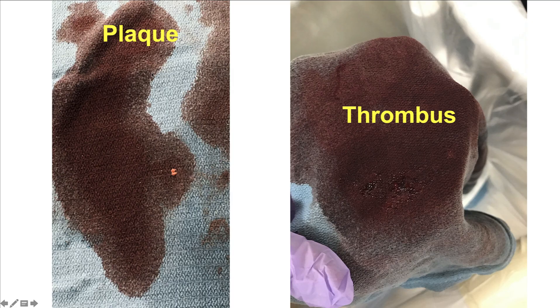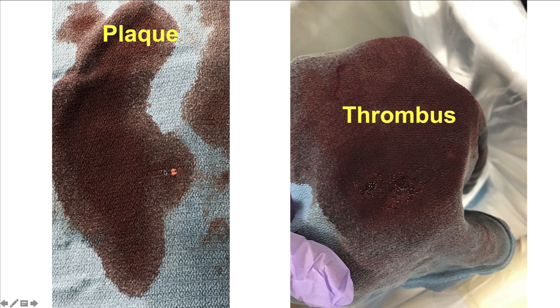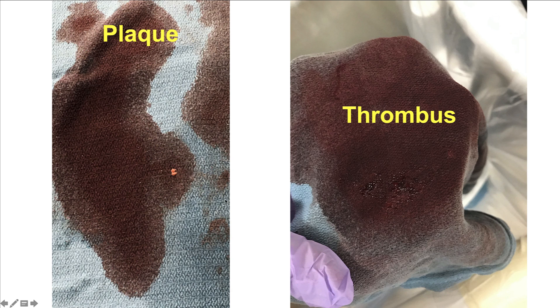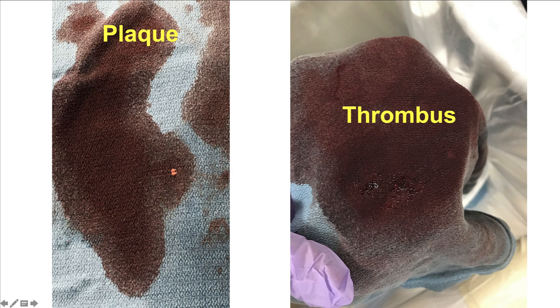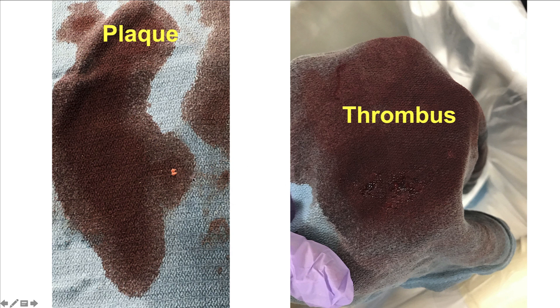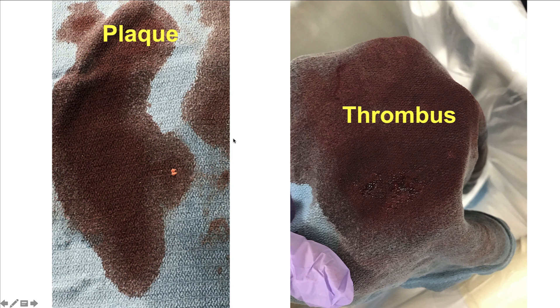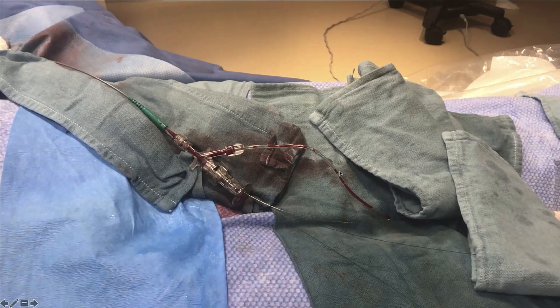These are examples of plaque and thrombus aspirated from guide catheters. If the guide catheter had not been prepared in a meticulous fashion, this material could have embolized into the coronary artery or systemic circulation, causing acute coronary obstruction or systemic embolization such as stroke. The message is: before advancing a catheter, it is critical to aspirate the sheath, discard the content, flush with normal saline, and then advance the catheter. Also, before injecting contrast into the coronary arteries, aspirate the catheter once again to ensure there is no debris or thrombus.